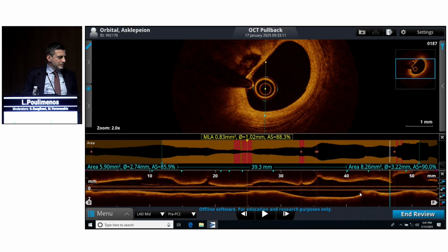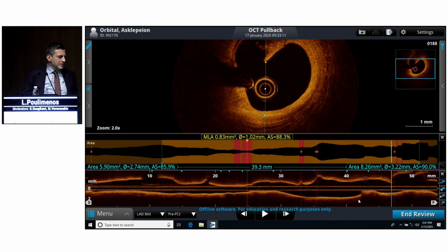Here we are approaching some other possible ruptured plaque. Yes. So it's a mix of a stable plaque, an advanced plaque. We read that as an ulcer. Okay. Correct. And that is going to explain also the next imaging you are going to see. Yes. Can you go ahead?